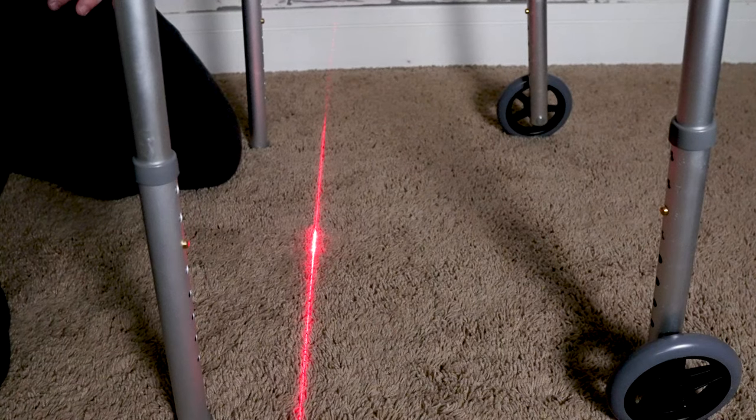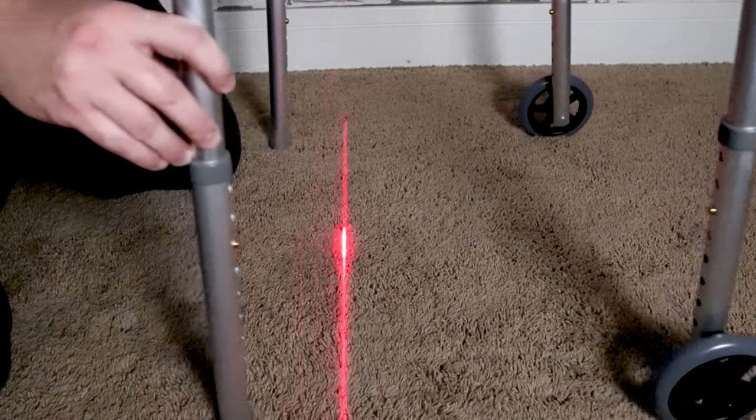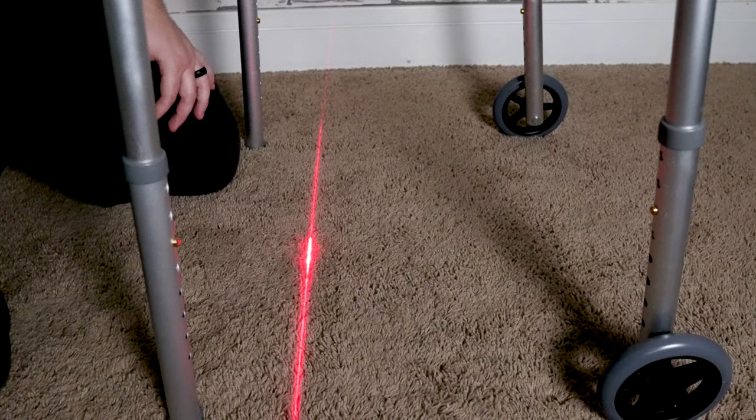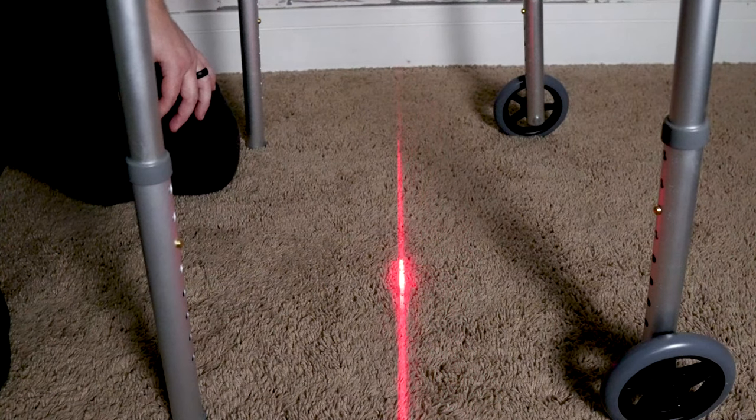I'll show you what it looks like. As you can see, the laser line is lined up right here with the device. It, of course, moves right along with the device, and it's really easy to make adjustments if you want to change how far you want them to step forward.